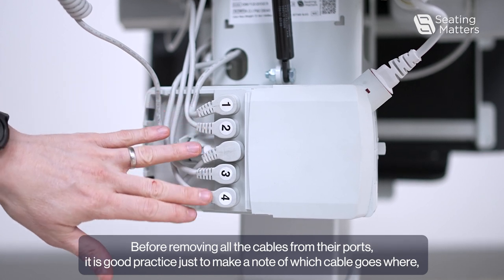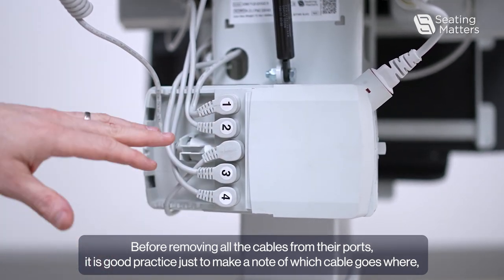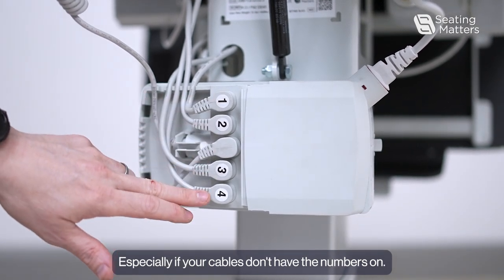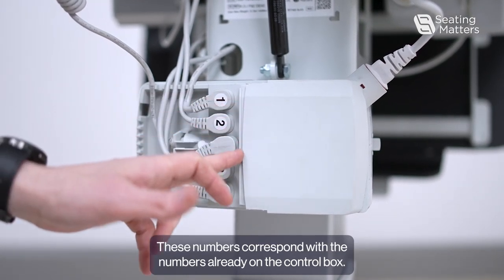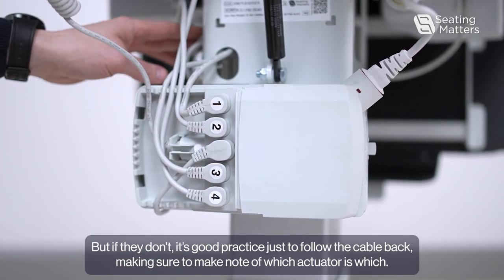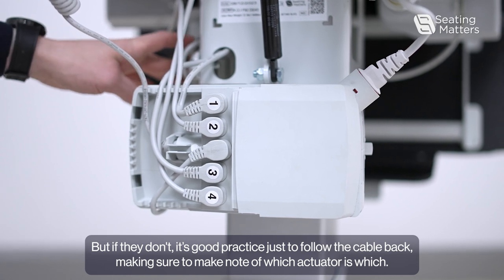Before removing all the cables from their ports, it is good practice to make a note of which cable goes where, especially if your cables don't have the numbers on. These numbers correspond with the numbers already on the control box, but if they don't, it's good practice to follow the cable back, making sure to note which actuator is which.